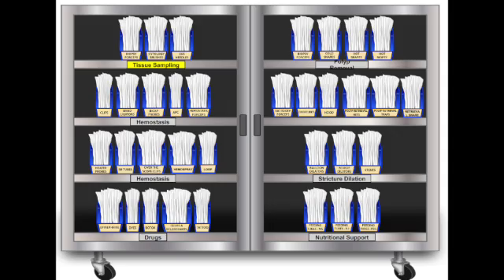So let's start at the beginning. Tools that just help with the initial look around, the basic diagnosis. Sounds good. Let's begin with something that seems simple but has huge benefits. Right. The cap, or distal attachment. You just secure it to the end of the scope. And straight away, it does two key things. Two crucial things. Use number one is all about visualization and stability.